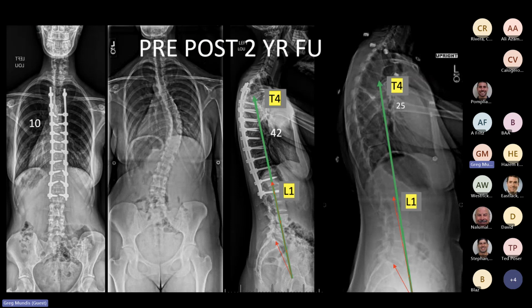And so here she is at her 2-year follow-up, and had a really nice radiographic result. We got her kyphosis restored, her L1 T4PA looked pretty darn good. They weren't too off ahead of time, and things look pretty good there in the coronal plane.